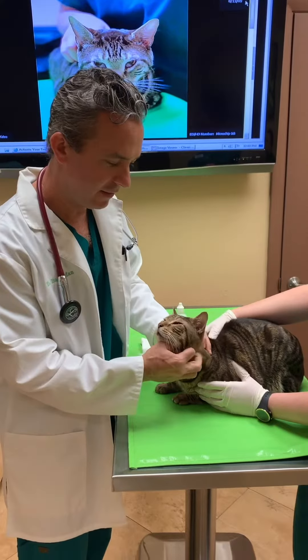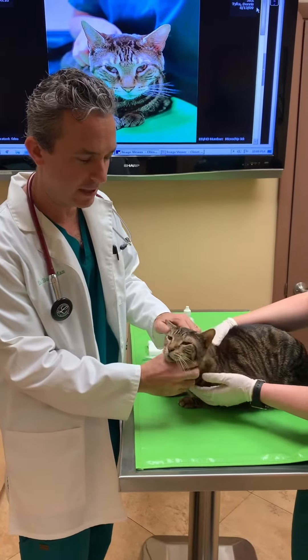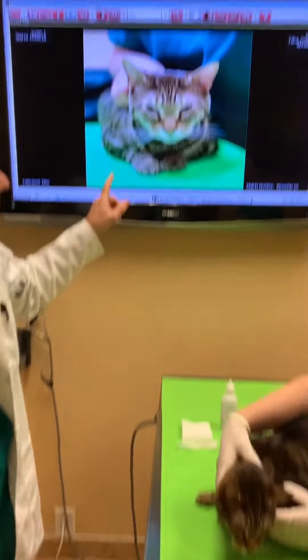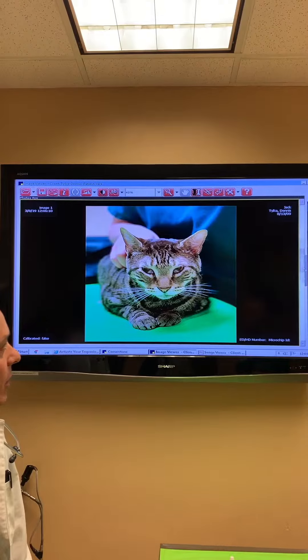We're here with Jack today. He's about nine years old, almost ten, and he came in today because he has a wound above his left eye. You can see here that his eyelids are showing his third eyelids, and that's because he was given a medicine to help relax him.